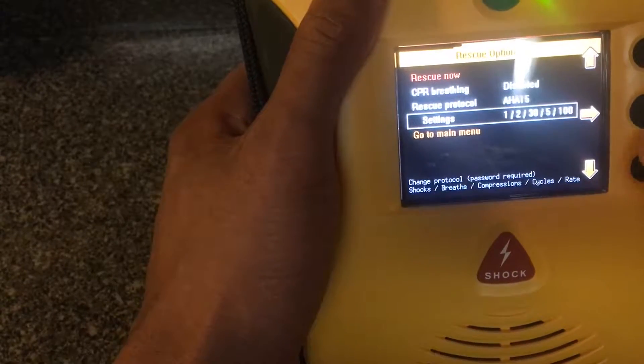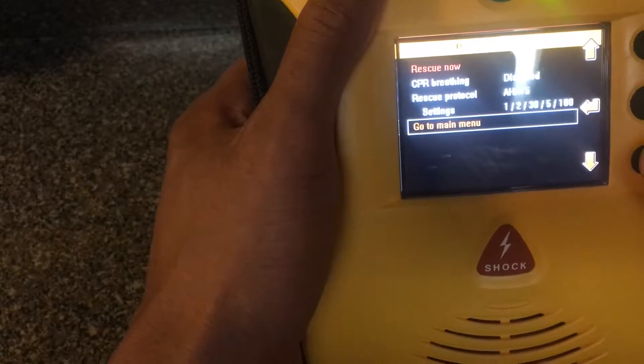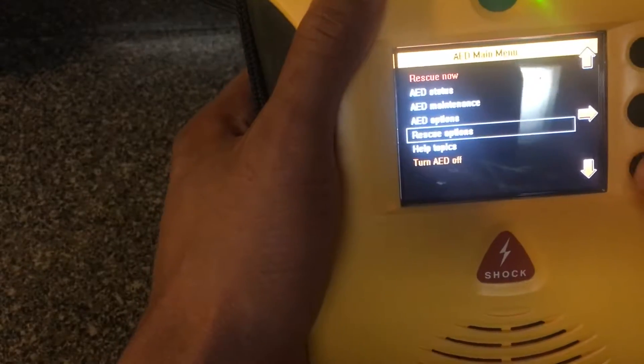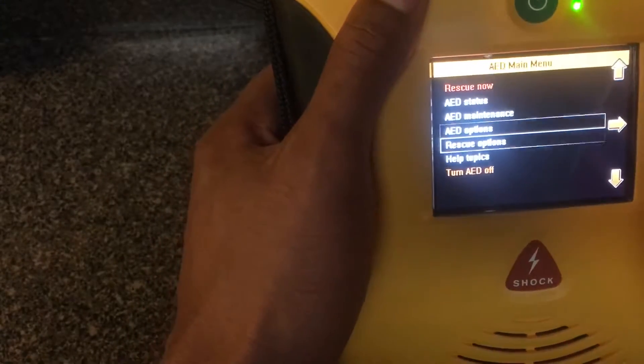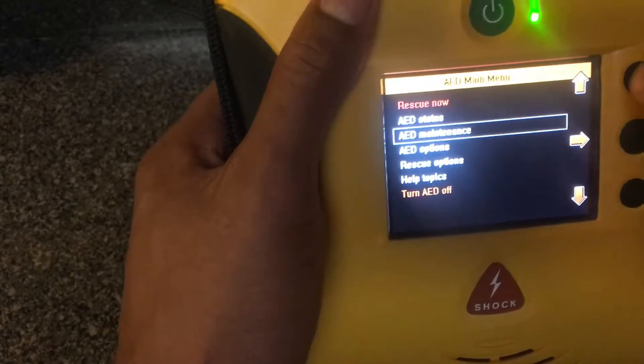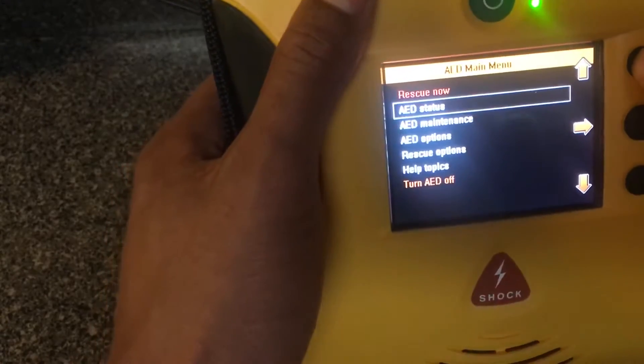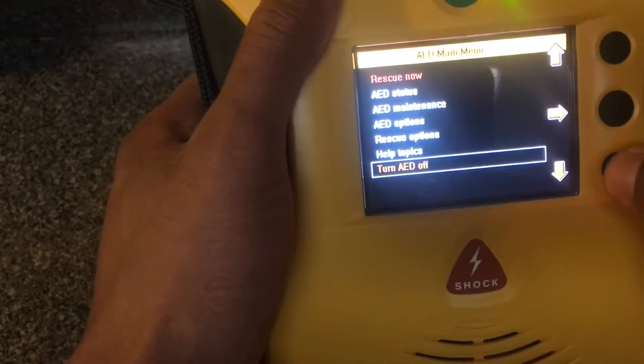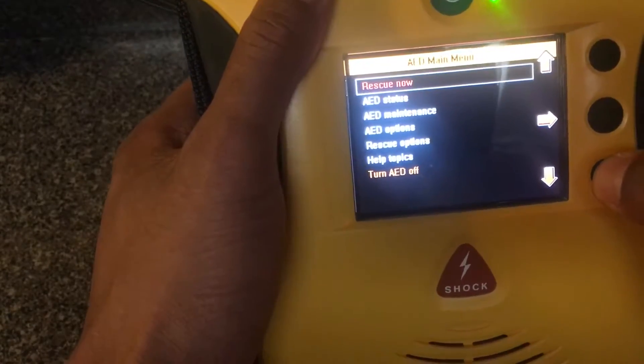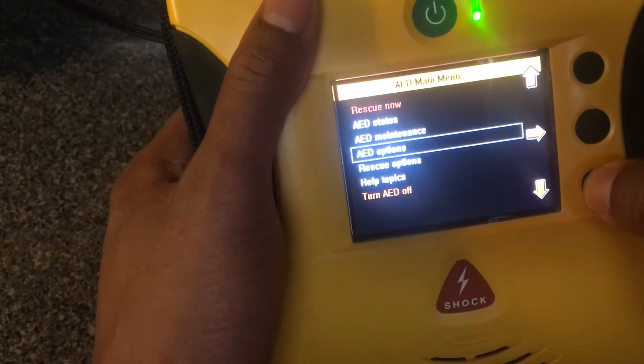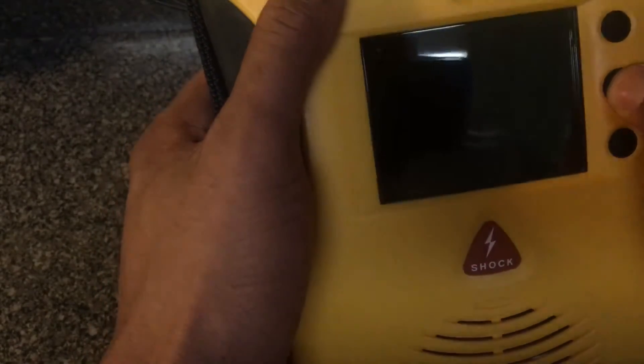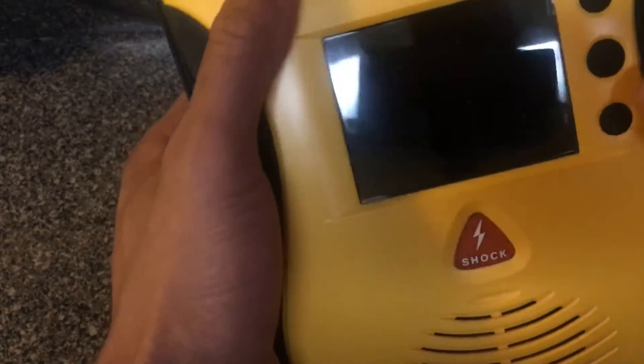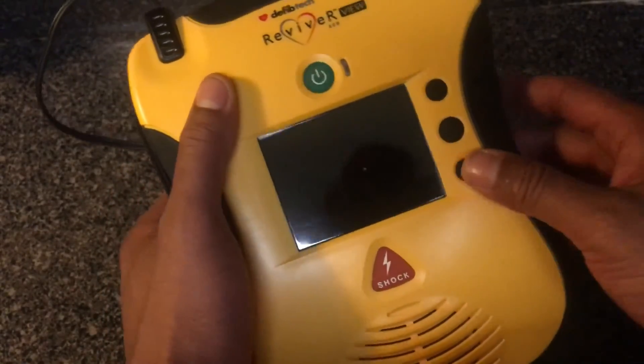It has rescue protocol and then settings. There's a whole bunch of different options. I mean, you want to toggle through that, read the menu or read the brochure, the booklet that comes with it for instructions, and then that'll help you get through this defibrillator. And that's the defibrillator.